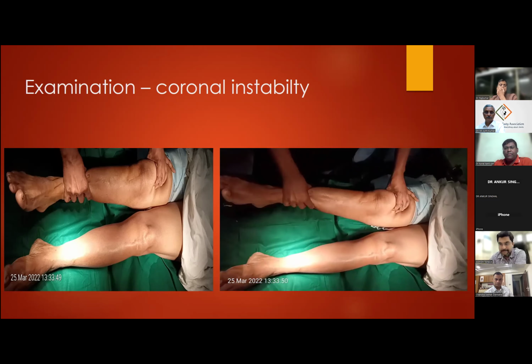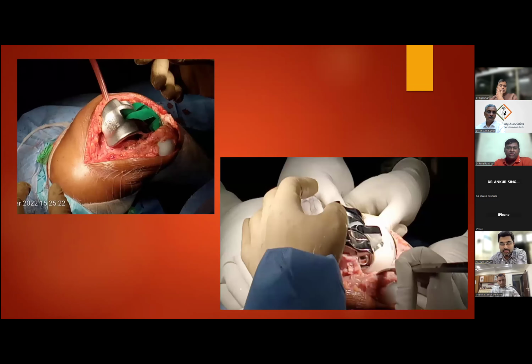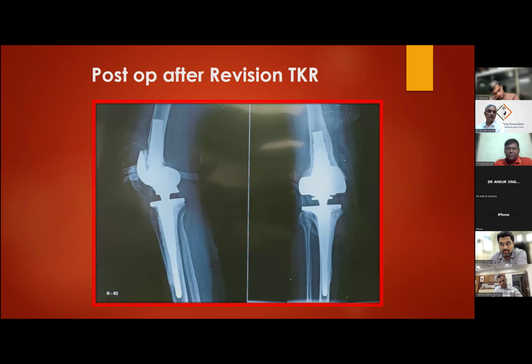What you did. So this is the Zimmer Osseo TI implant after removal. We used a rotating hinge prosthesis. This is a post-operative X-ray. We have used sleeve and augments also. But one thing, this is the shortest sleeve we have got in our OT, and the bone quality is so poor. You can see that the sleeve is actually abutting the anterior cortex.